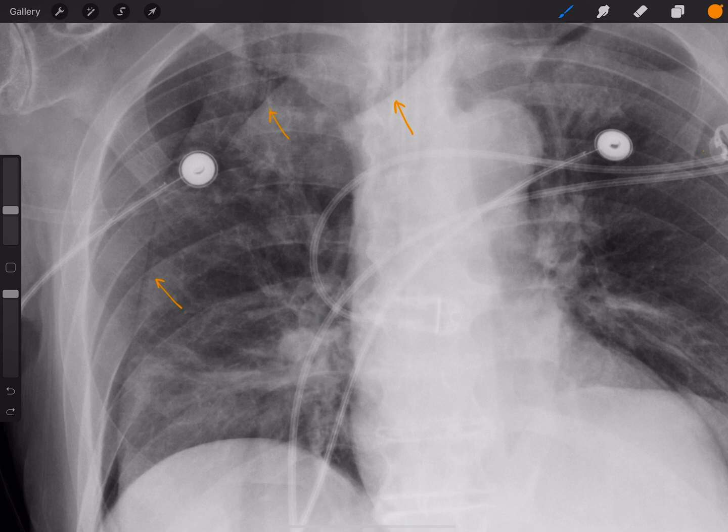Reason number two is that if you follow this line superiorly, it starts to fade off — you actually don't see it up here. A pneumothorax will be visible all the way to the apex. It won't just fade away like a skin fold will.